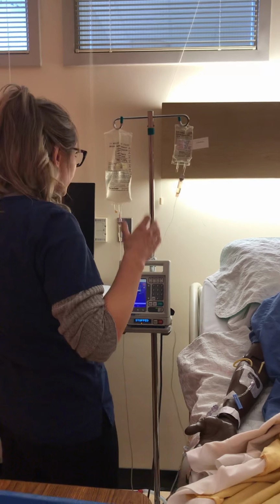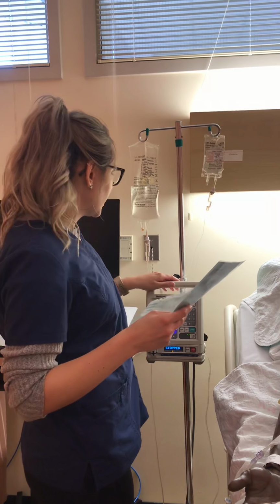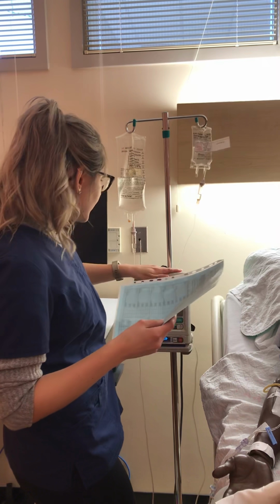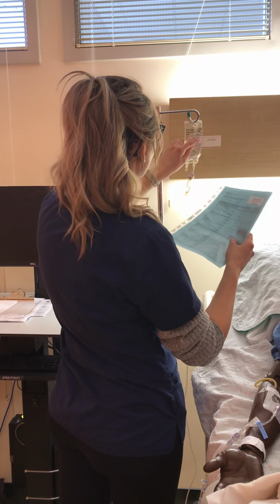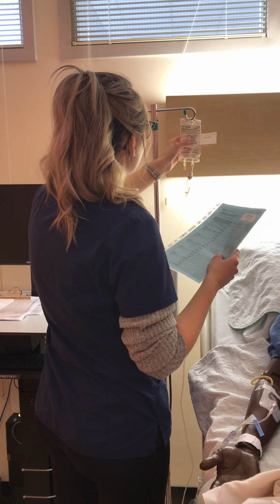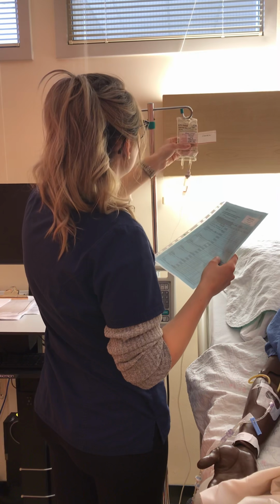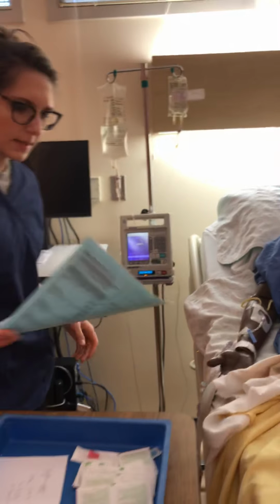Okay, so now I'm going to do my third check with my buddy nurse, and she's going to confirm that the MAR to the bag to the pump settings that I have here. So we have the right patient, Ryerson Scott, right drug, insulin R, volume is 101 milliliters, the dose is 100 units, running at 2 units per hour, also 2 milliliters per hour. The time is now, and the route is through the IV, so my second nurse has done that check.